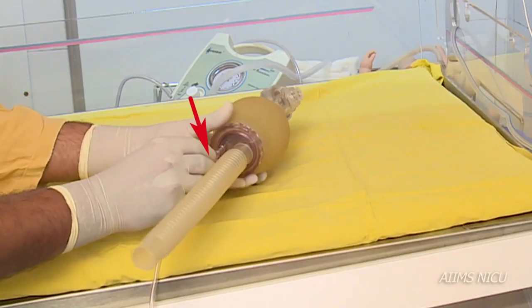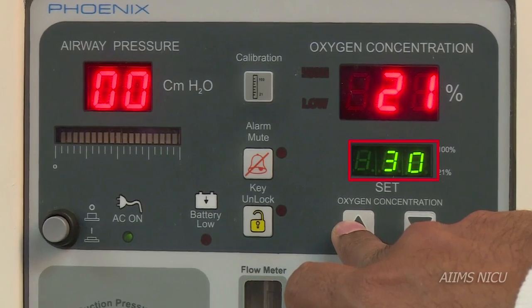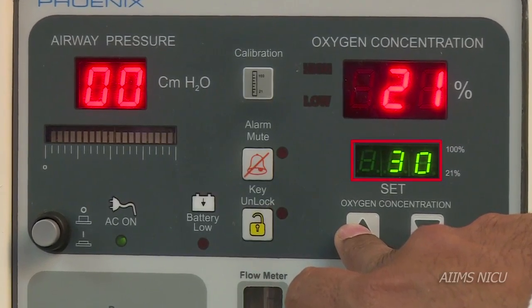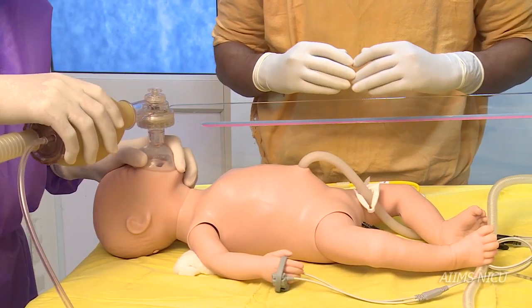Connect the oxygen tubing to the bag and set the FiO2 on the blender at 30% when you decide to initiate bag and mask ventilation. The bag and mask is now ready for use.